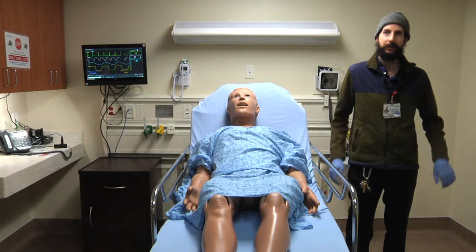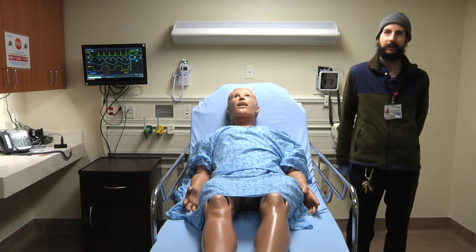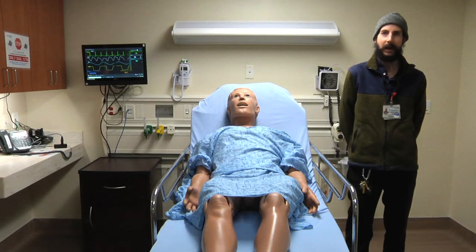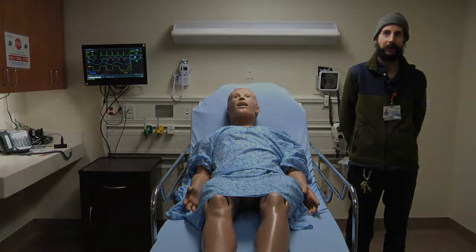So welcome to the Simulation Center. My name is Brian Hanlon, and I'm going to be introducing you to your patient today. So this is HAL. HAL is one of our patients here down in the Sim Center.